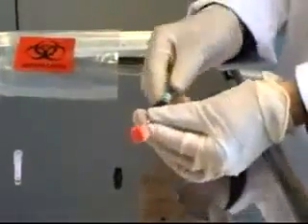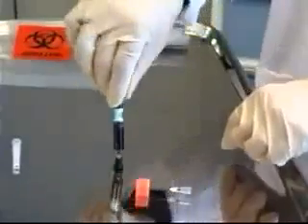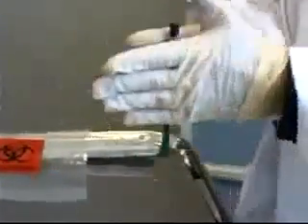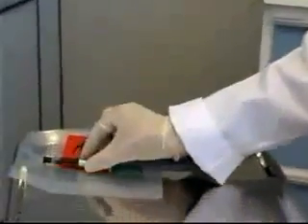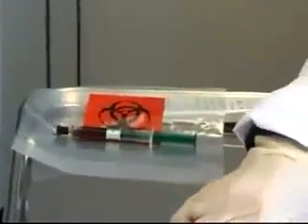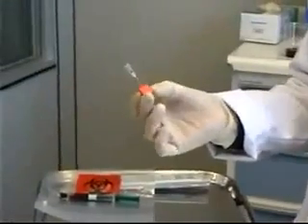I can now remove the cube and needle as one and attach the black cap to the tip of my syringe. I can give it a roll to make sure that the heparin has dissolved, and I can place it into the bag of ice and send it off to the lab. My last step is to dispose of the needle and cube in the proper sharps container.